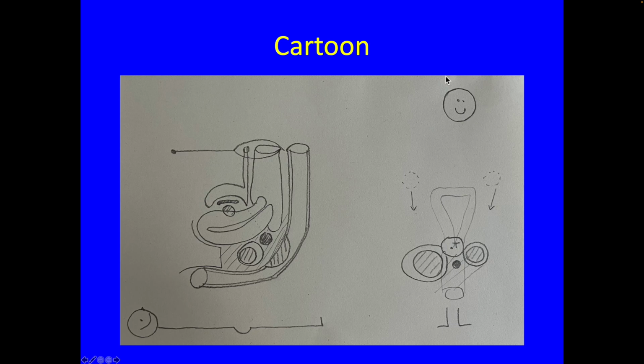Then I like to say in the longitudinal view, coronal really, there's the level of the torus, the ovaries are both adherent to it, that's the deep endometriosis. And I think it helps to explain that you cannot get this view at laparoscopy.